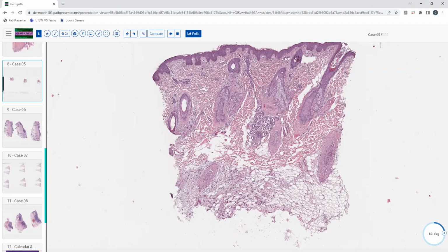I was thinking this was just androgenetic because it seemed like the hair follicles maybe had variable diameters and there were more prominent sebaceous glands. Well, let's look at one other thing too. What stage are these follicles all in here? Are they all in telogen? They're actually, this one's almost to telogen. This one's probably heading towards telogen. These are catagen moving towards telogen.